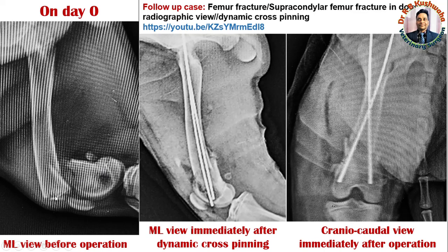You could see this fracture end is very close to the skin. This is the patella and these are the two fabellae which are looking at an end-on position. This is immediately after doing the cross-pinning.